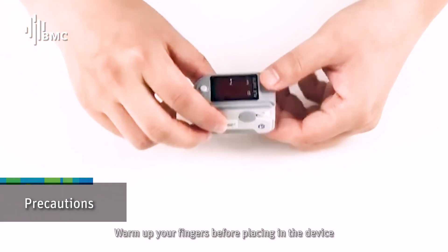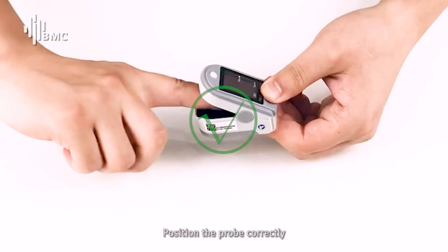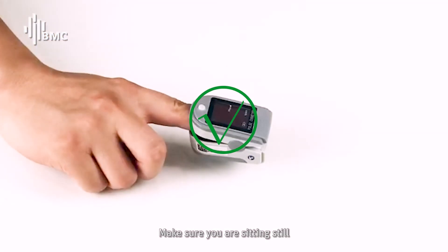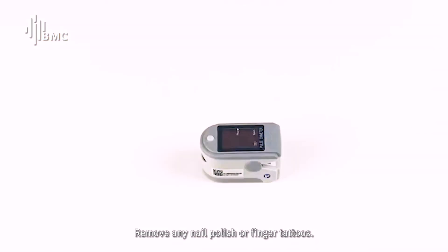Precautions: warm up your finger before placing it in the device. Position the probe correctly. Make sure you are sitting still. Remove any nail polish or finger tattoos.